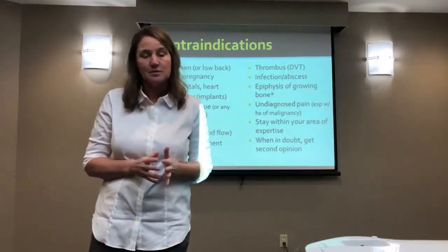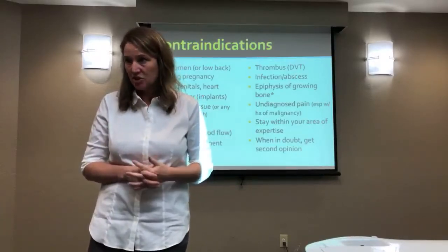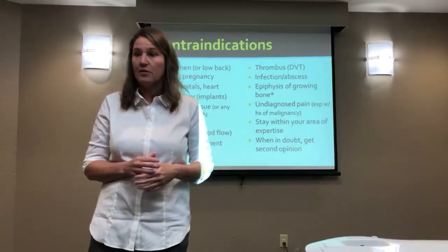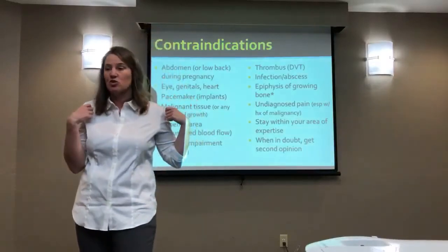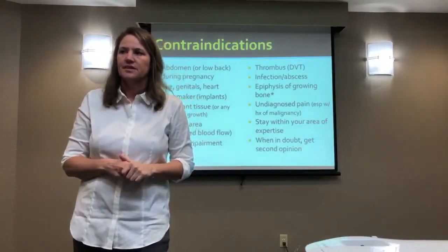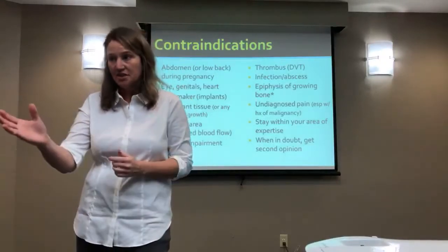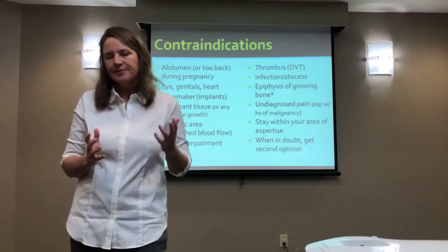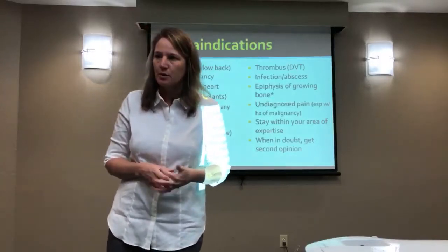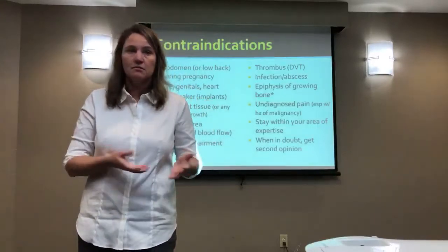His personal experience, which I wouldn't discount, but I would find it hard to believe that for somebody who has sensation, you would be capable of damaging their muscle to the extent that he's describing without them running out of there. They would withdraw. So I do think it says the patient selection matters. How hot would it have to be to cook tissue? 115? He said it would have to be well over the pain threshold to cook the tissue, and whether it could possibly damage it, not if you pick your patient accordingly and they have sensation. If your patient selection is appropriate, you're not going to harm anybody. The potential is there, but you're not going to do it because you're going to be a good advocate.